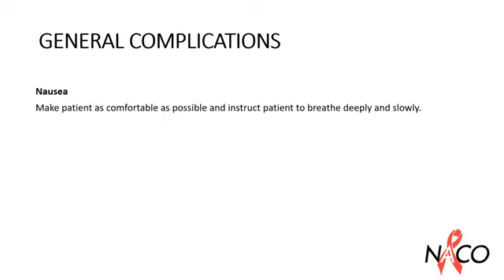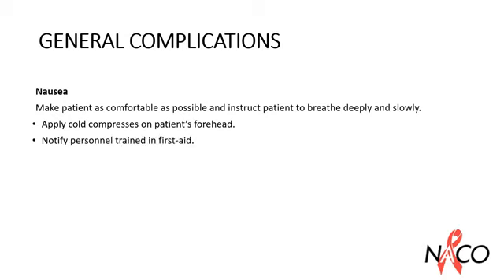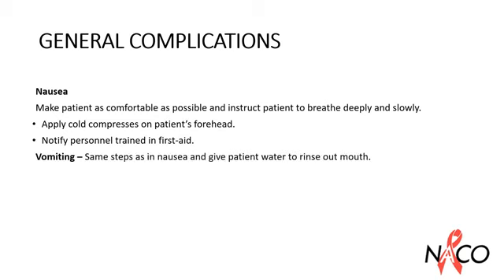Amongst the general complications of phlebotomy, nausea and vomiting are quite common. If the patient is feeling nauseated, make the patient as comfortable as possible and instruct him to breathe deeply and slowly. Apply cold compresses on the patient's forehead and notify personnel trained in first aid. If the patient is vomiting, the same steps as in nausea have to be followed and the patient has to be given water to rinse out the mouth.